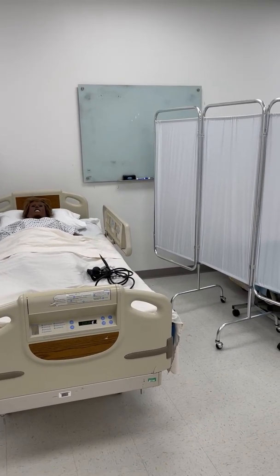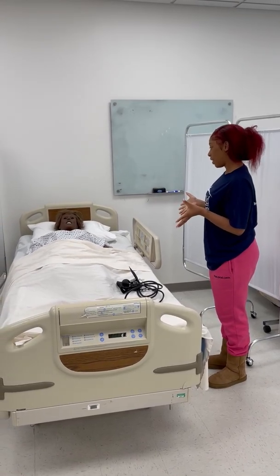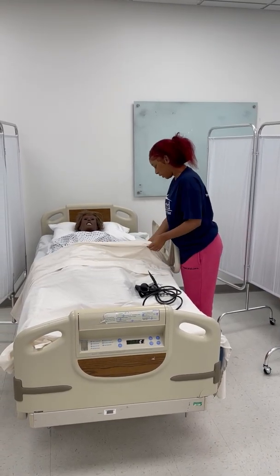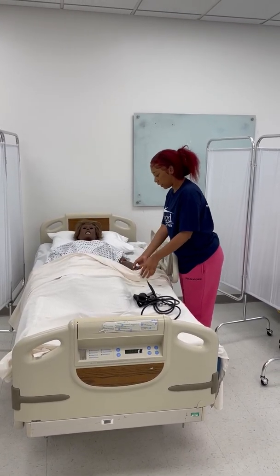Knocks on door. Hi, my name is Morgan today. I will be your nurse. I'm going to be taking your vital signs. What is your name? Okay, great. And your date of birth? Do you have any allergies? No, and you're not experiencing any pain?